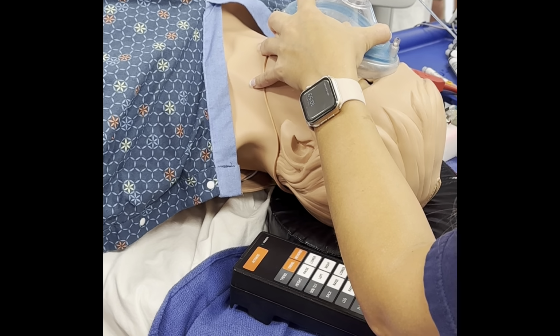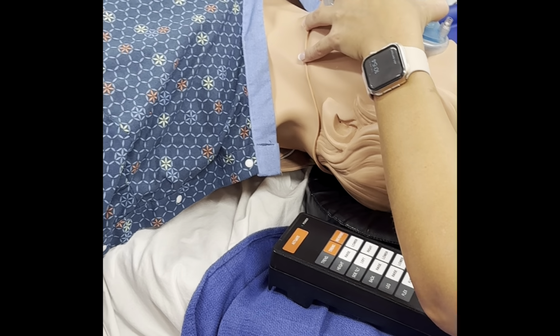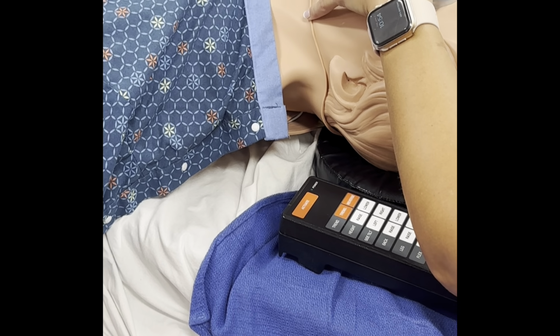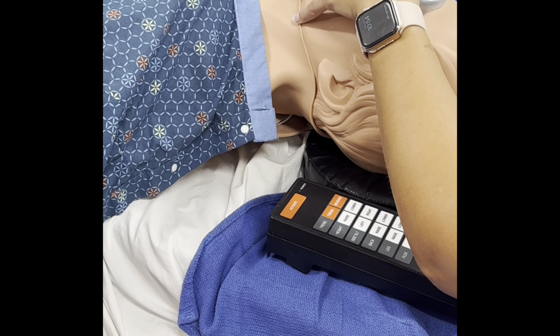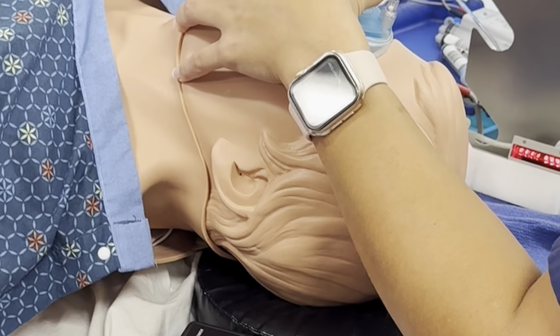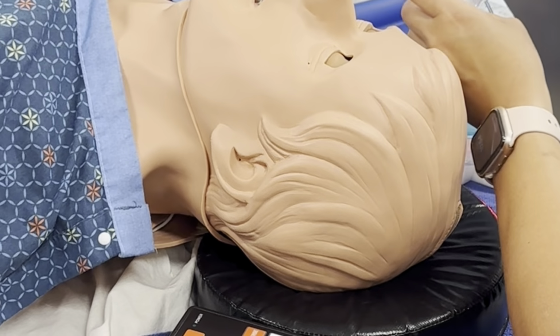Again, the machine just goes based off of the medications that you give. In a real patient, maybe the blood pressure does drop because of the propofol that you give. So then she knows that she's going to be able to handle it, or she's going to intubate the patient, so that will go up. All right, so let's say it's been your 60 to 90 seconds. So you normally wait 60 to 90 seconds for the muscle relaxant to kick in before you can intubate. And then we're gonna set this to the side.